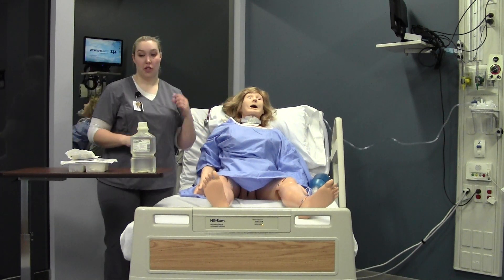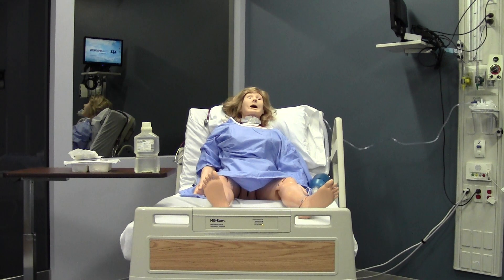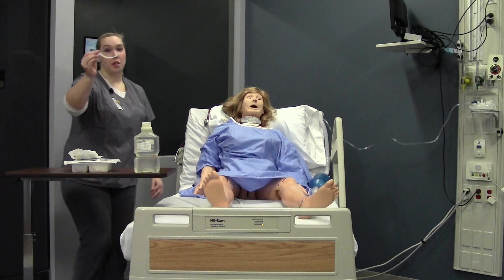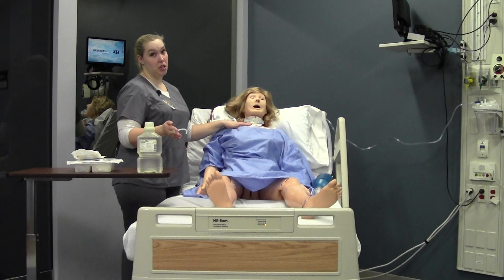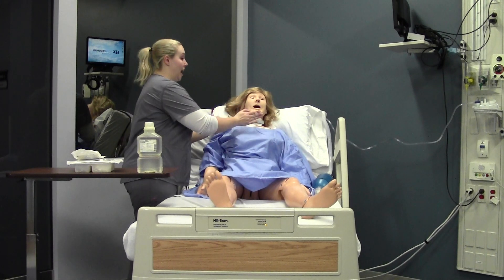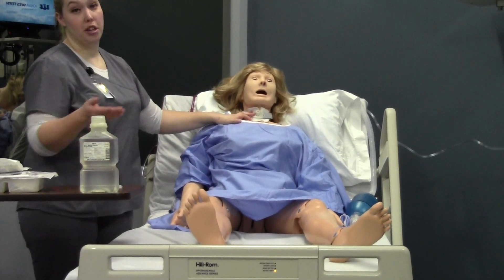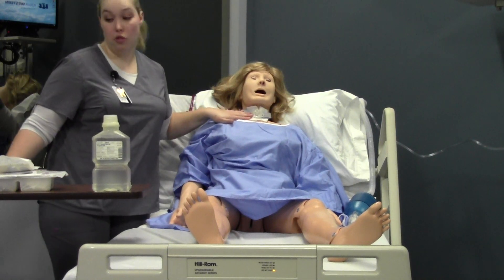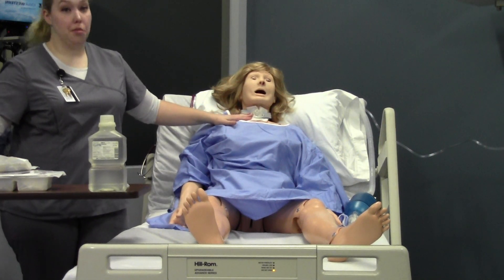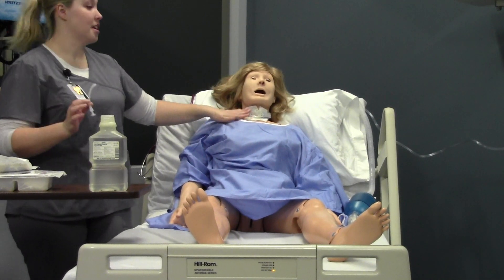With trachs, you need to know where their obturator is at all times. An obturator is a little plastic device that should be taped to the head of the bed or to your cabinet. If the patient coughs the trach out — especially if it's new, even if it's older — you guide it back in with the obturator, hold it in place, take the obturator out, and then call for help, as this is a respiratory emergency. If they lose that airway, especially if it's new, they won't be able to breathe and may end up coding. You need to know where this is at all times.